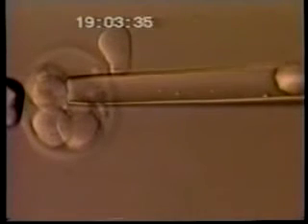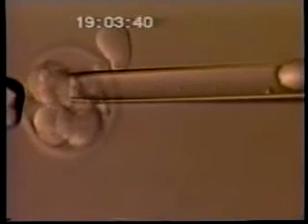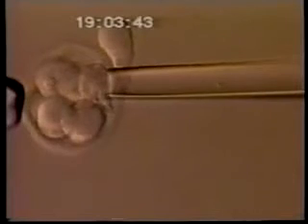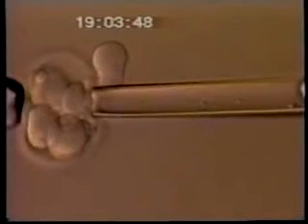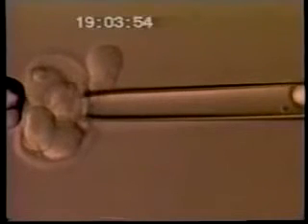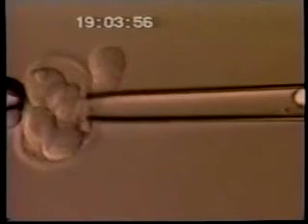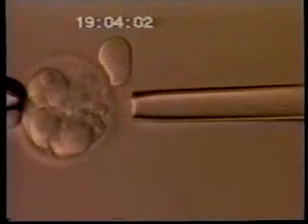The very last cell that you see that we're going to biopsy really will not tolerate the procedure and will be damaged by it. But luckily, the embryo itself has not been damaged. We still have one cell to examine, and we will not have really hurt the embryo in any way, despite the very great difficulty of doing this procedure at this stage. It has been demonstrated that removing 1 or 2 cells from an 8-cell embryo will not hurt the growth and development of that embryo. But if you remove more than 1 or damage more than 1 or 2 cells in an 8-cell embryo, that will severely limit its ability to develop.